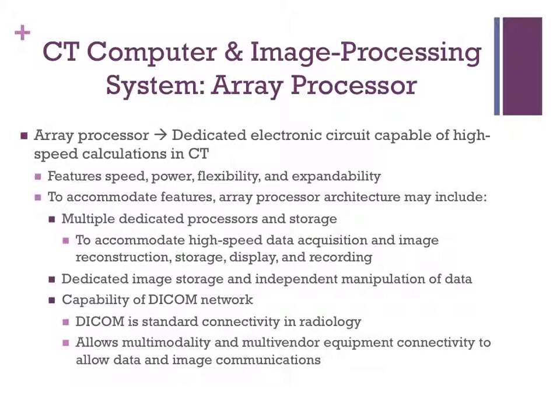And it could include the capability of DICOM network. DICOM is a standard connectivity in the radiology department. I'm sure many of you have already heard of this, if not, already know it in depth. DICOM allows multimodality and multi-vendor equipment to connect electronically to facilitate data and image communications within a department.